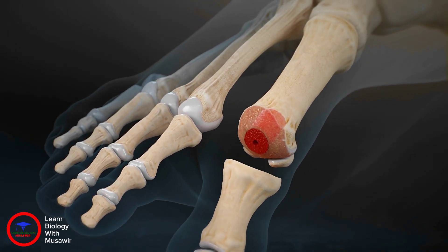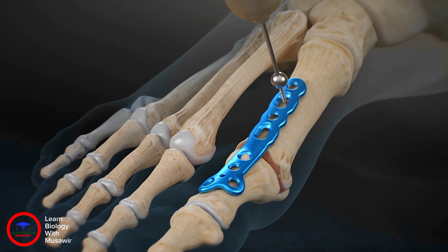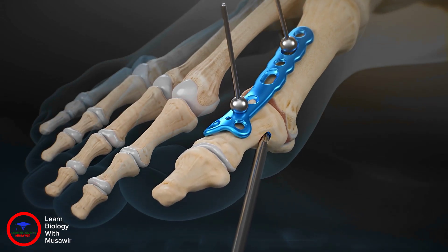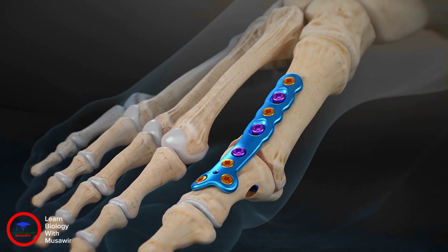Place the joint in the correct position and temporarily fixate the MTP fusion plate with BB-TACs. From this point, continue following standard practices for fixating the MTP plate and completing the fusion.